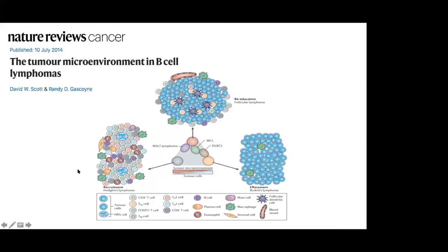For instance, in the Hodgkin lymphomas, the cellularity is quite low. You have some sparse tumor cells on a background of inflammatory cells, quite a plethora really. This is in contrast to an indolent non-Hodgkin lymphoma and an aggressive non-Hodgkin lymphoma, where the cellularity is much greater.